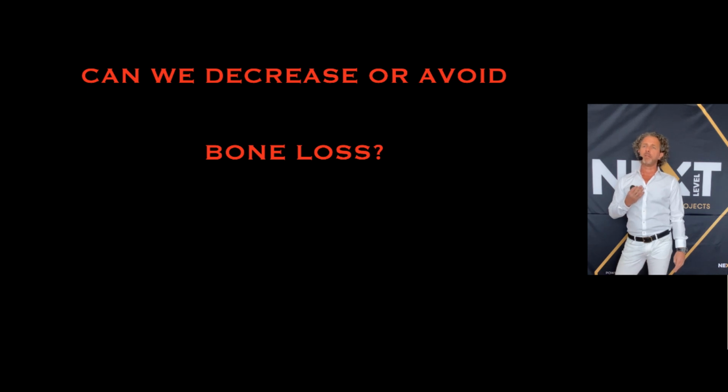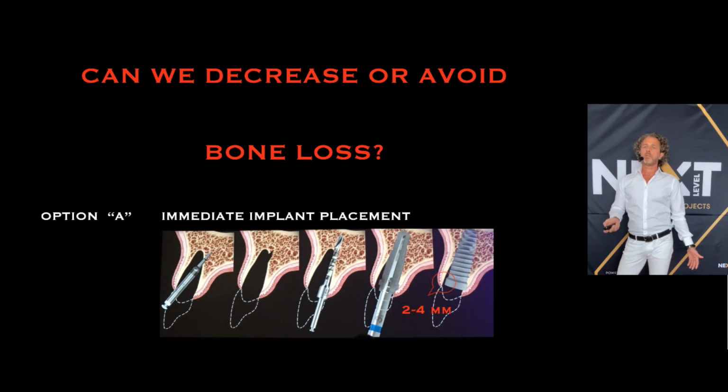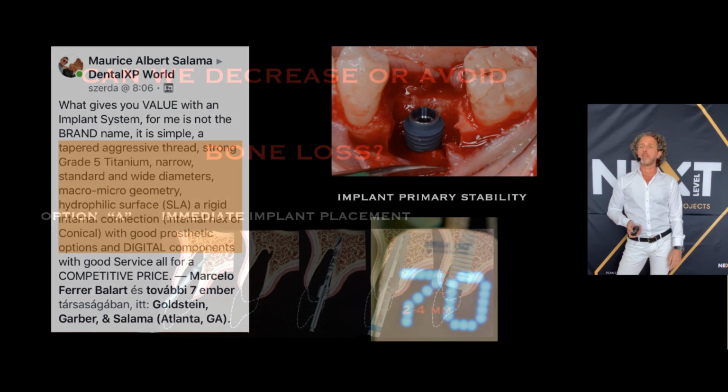So how can we decrease or avoid the bone loss? First option should be immediate implant placement. We know that we have to place the implants far more palatal from the existing root axis. Then we can leave 2, maybe 4 millimeters between the cortical shield and the implant surface. This is what we call kind of jumping distance.